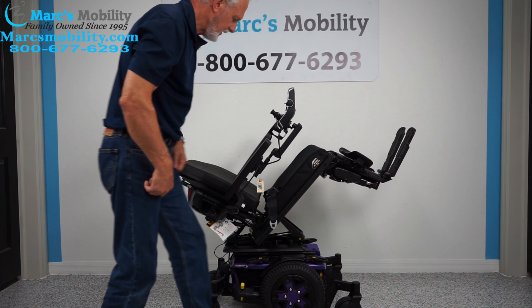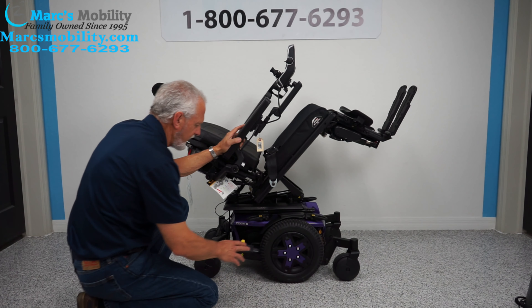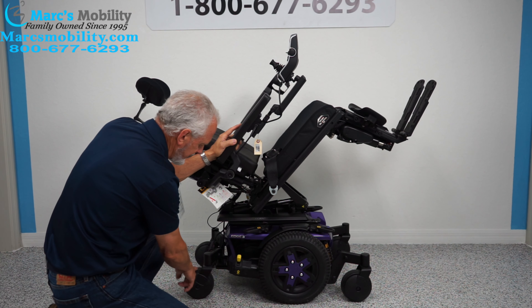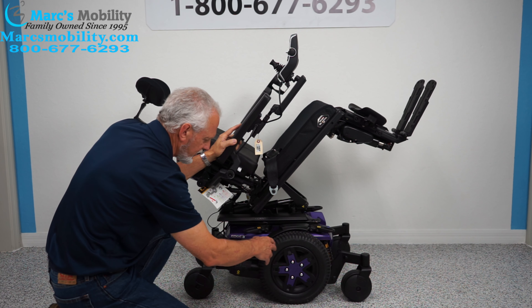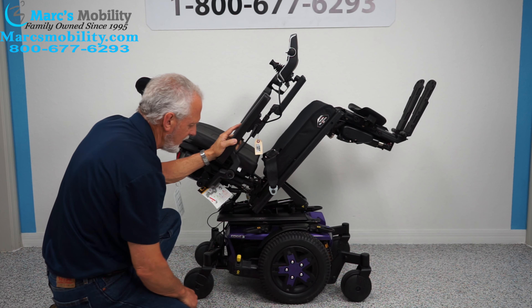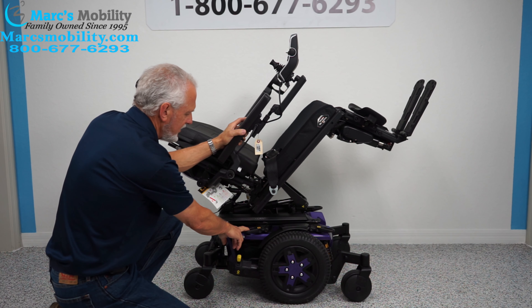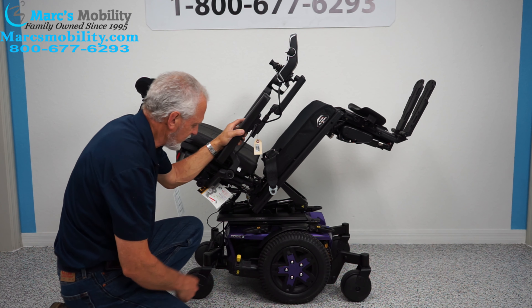While we have this tilted, let's look at the base. We have here 14-inch solid wheels. This is a mid-wheel drive — you have wheels in the back and wheels in the front on the ground, so you really have six wheels on the ground. This gives it the best turning radius. These are your anchor points — you have one here and one there, bolted to the frame. This is where you secure your chair to your lift or to your van for transportation.